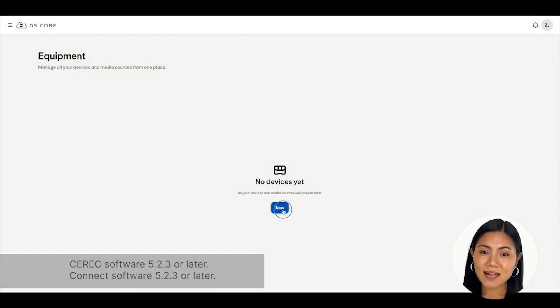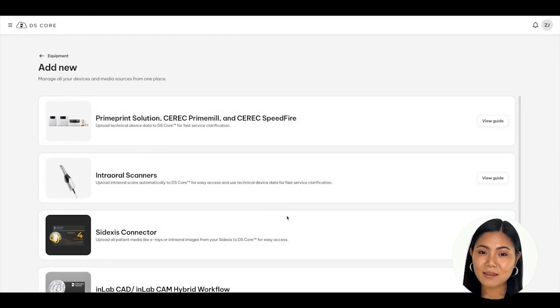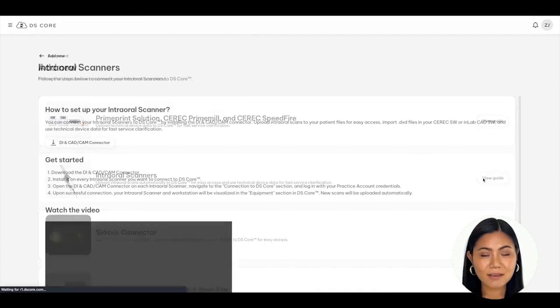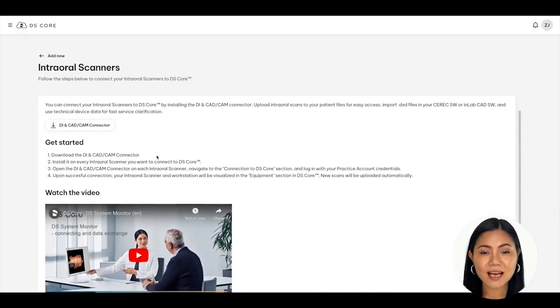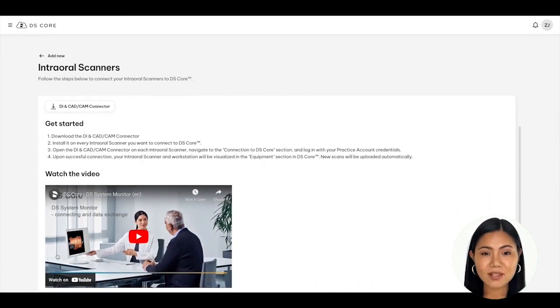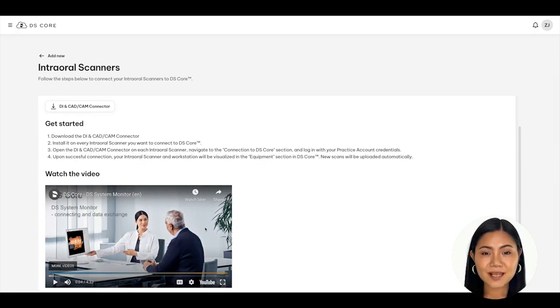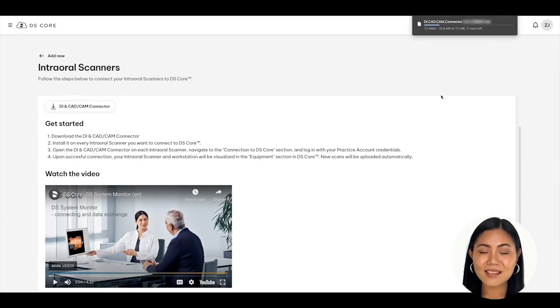Navigate to your equipment list and click the blue button. Once you see a list of devices to connect, scroll to the Intraoral Scanners section and click on the white View Guide button. A set of instructions will appear on how to start connecting your intraoral scanner. Follow the four steps, and if you need additional assistance, you can watch the setup video. To download the connector in Step 1, simply click on the white DI and CAD/CAM connector button to start the process.